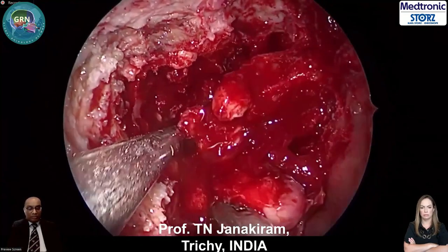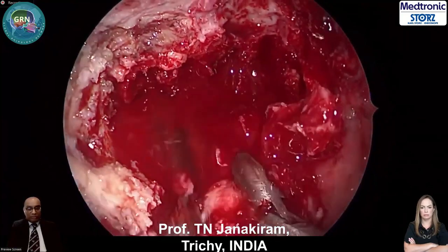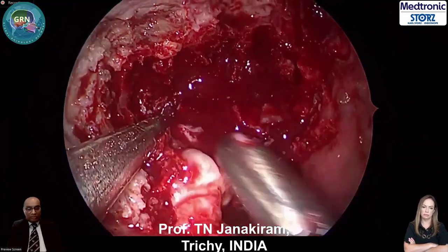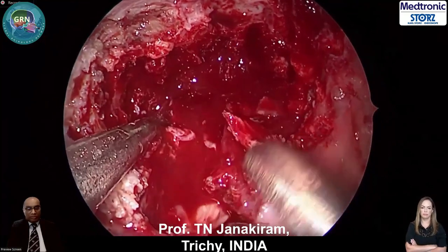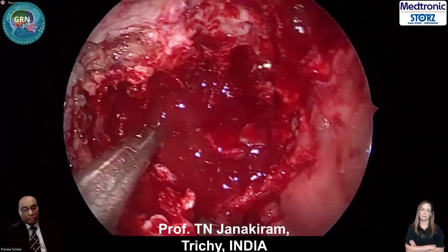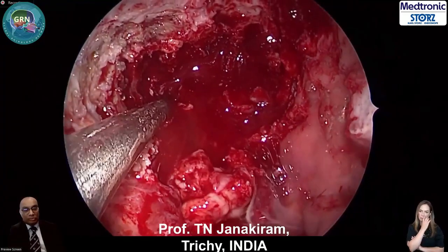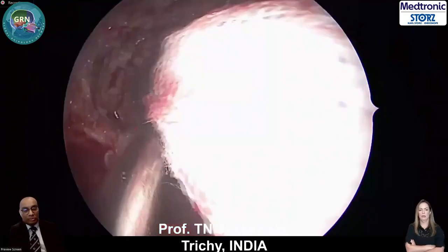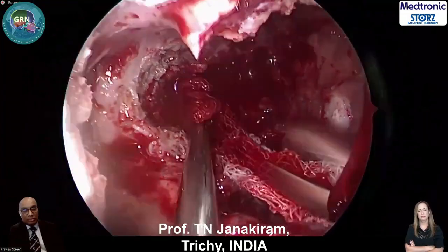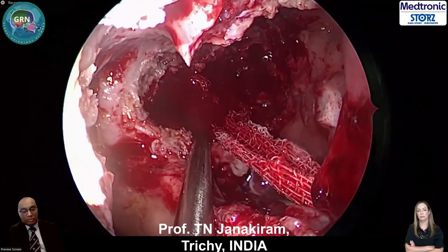So again, the rolling down maneuver. That's it, mostly over. Give me a pack. Long pack. So what you have to do is to keep that area fully filled with long packs. That's it. Just pack it for some time. The bleeding will stop. And then you start drilling that area completely.